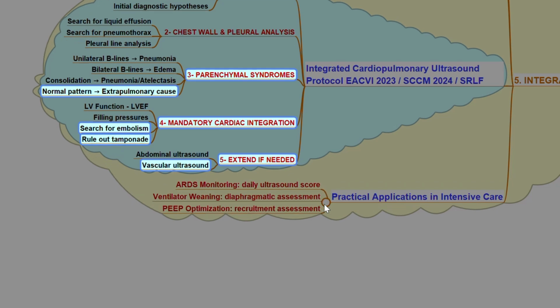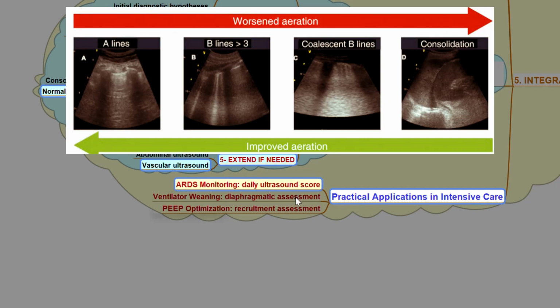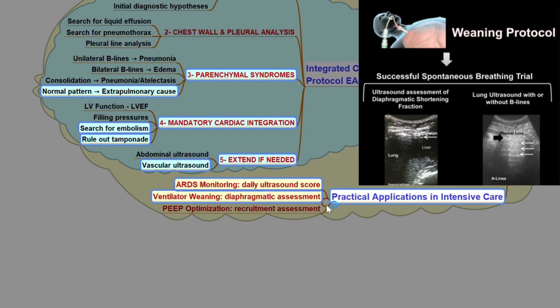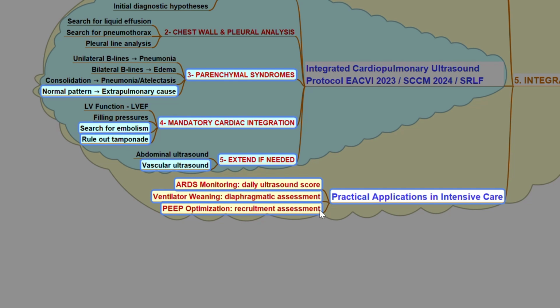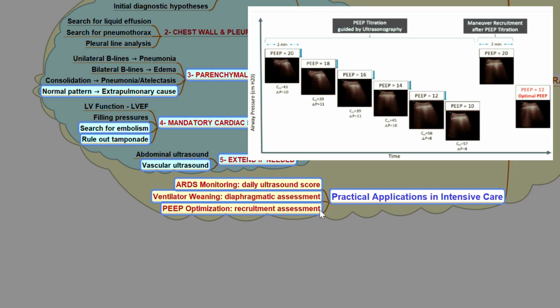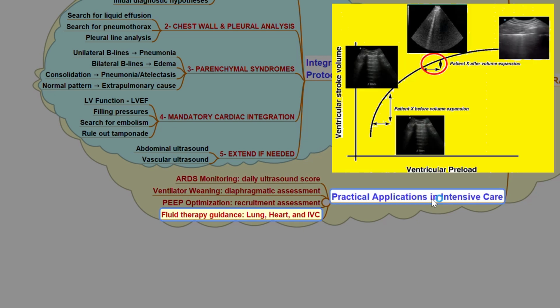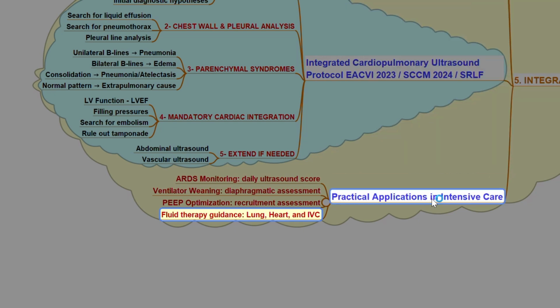This integrated approach is used daily in ICU practice for ARDS monitoring, daily lung ultrasound score, for weaning assessment, assessing the diaphragm excursion and thickening fraction, in PEEP titration and evaluation of lung recruitment, hemodynamics, and also for fluid management by integrating findings from the lungs, heart, and IVC.